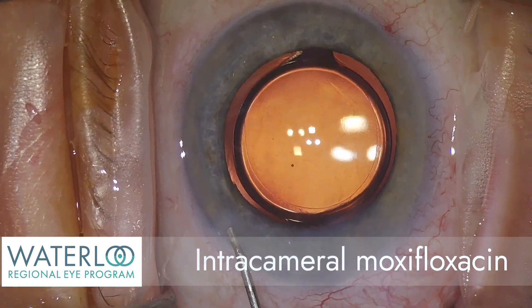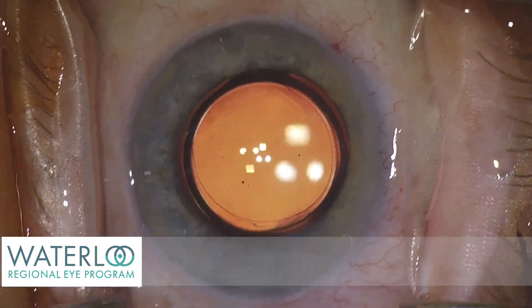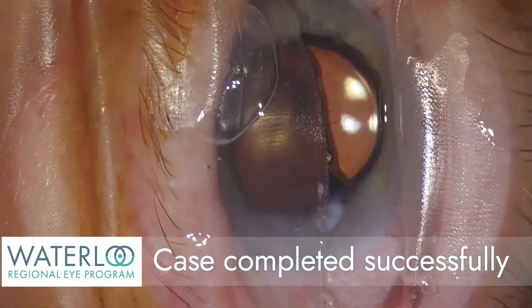An antibiotic can be injected at the end of the case. The wounds are well sealed, the eye is nicely pressurized, and the case is completed successfully.